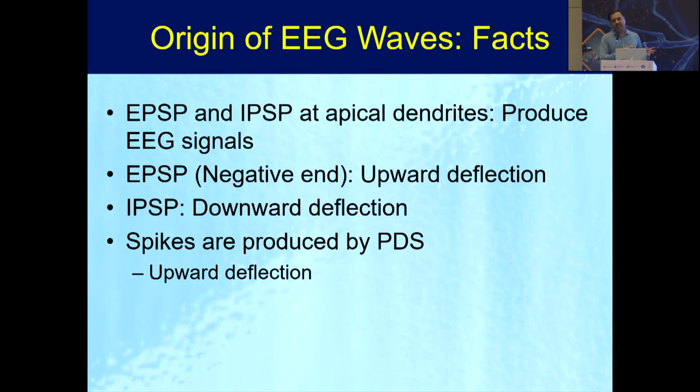The potential produced from one single axon or one single cell will be too small to be detected. So a large number of dipoles from a group of neurons firing together will produce the normal EEG signal.